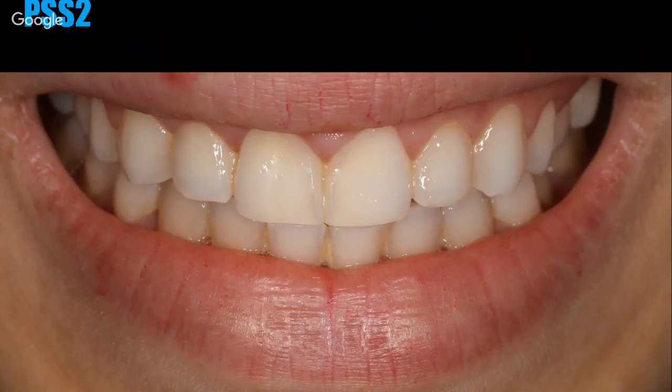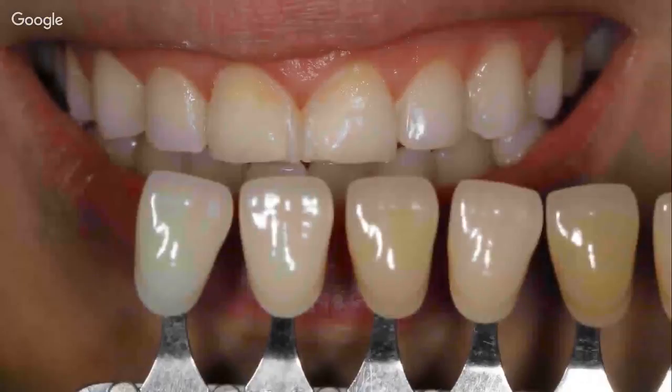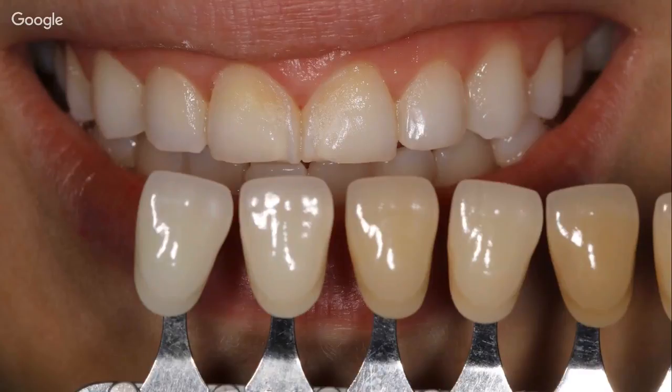This was the second. And this was the third. So right now you have 3 designs or 3 simulations for 2 teeth tailored to that patient's need. You don't have to get those templates and start to align them on top of the patient's teeth. Patient then sees those pictures, and of course she opts for the third option, which is simply 2 restorations on the teeth and bleaching for the others.